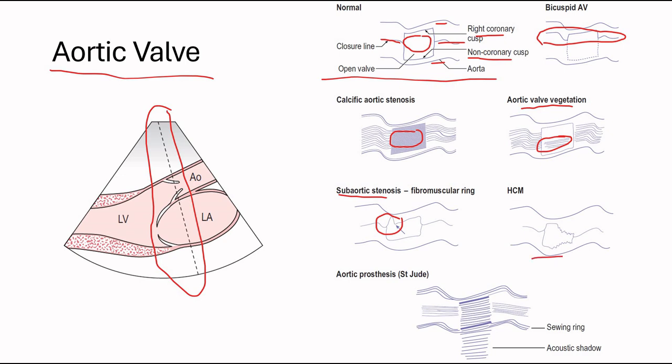And in HOCM, it looks like this. And that's because if there's obstruction at the LVOT, then the leaflets will close earlier compared to normal. And there is less blood flow there during the obstruction. And here is aortic prosthesis, St. Jude's. You get this acoustic shadow down here.